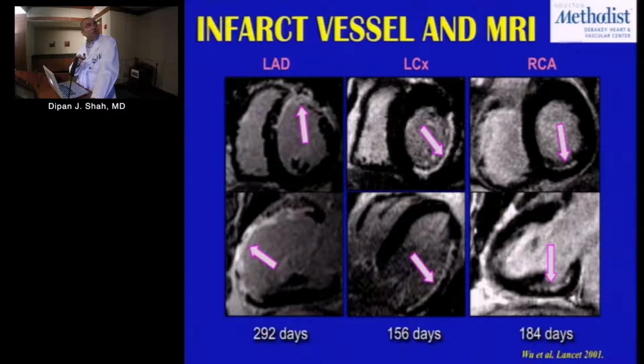Now, notice I use the terms carefully because there's obviously a difference between scarred myocardium, which is in a chronic setting, and acute myocardial infarction, which is an acute setting. And I'll show you later on that this CMR technique appears to work in both the acute setting as well as in the chronic setting. And so that's why the best terminology probably is to refer to it as irreversibly injured myocardium. By simply looking at this, I can't necessarily tell if this is acute versus chronic. Now, there's other clues that we can use to help identify that. But the reality is hyperenhancement will occur in both settings.